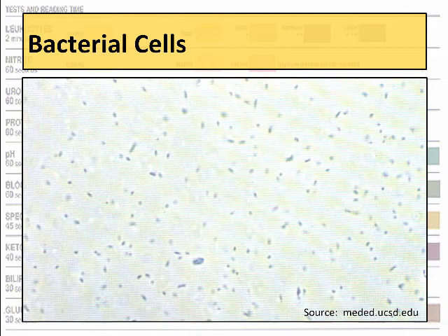Often, if you do find that there's a high level of bacteria in the urine, you will follow it up in the lab with a urine culture. Basically, we try and grow what's there because we want to figure out what it is so we can figure out how to treat it. So that's the follow-up procedure if you do suspect a UTI or maybe an STI or something along those lines.